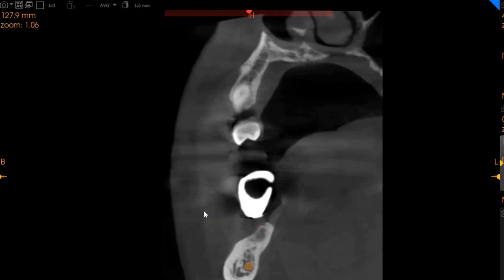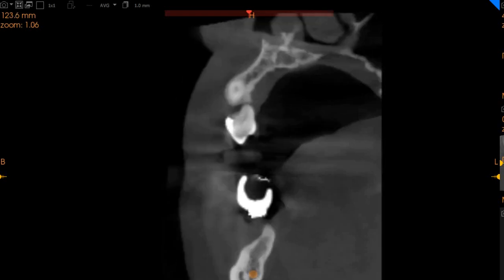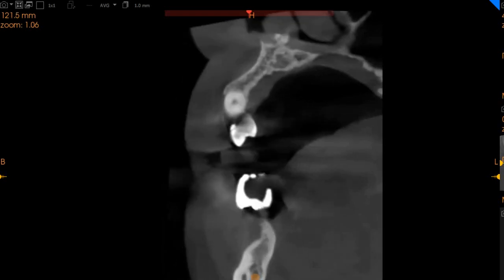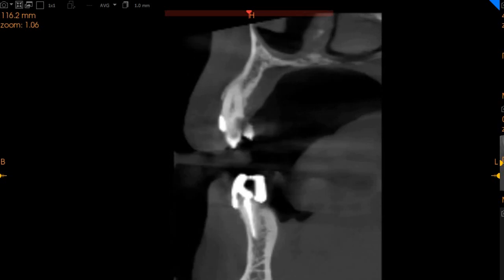This is the lower left six region — a very atrophied ridge, as you can see. Approximately four millimeters of ridge width and six millimeters of height, but this area cannot accommodate an implant because the bone quantity and quality are insufficient.